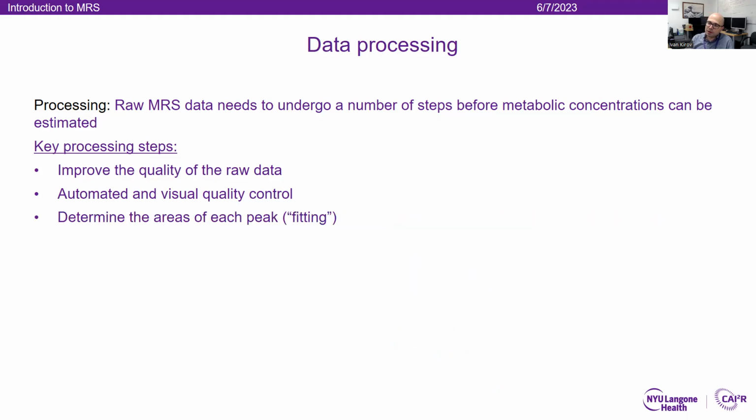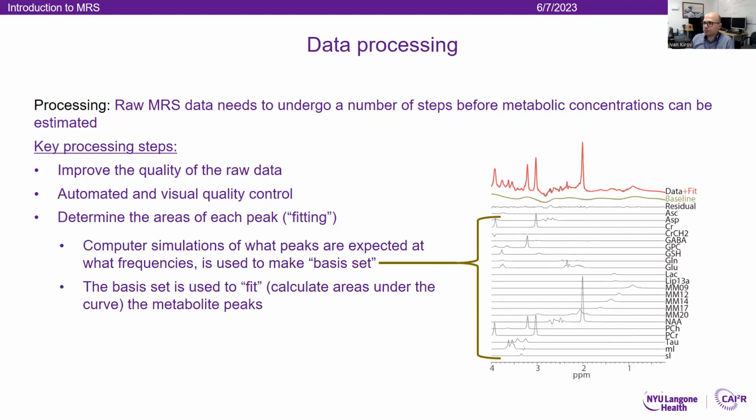Okay, and this would mean that we are ready to determine the areas of each peak. A very important process called fitting. The first step of this process is to run a computer simulation, which will tell us what peaks are expected at what frequencies, given the experimental parameters.